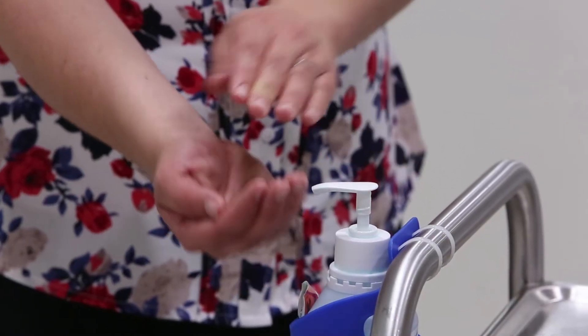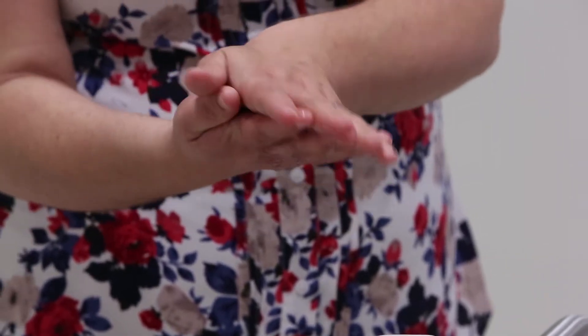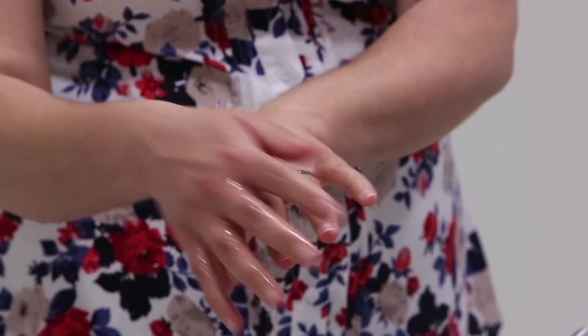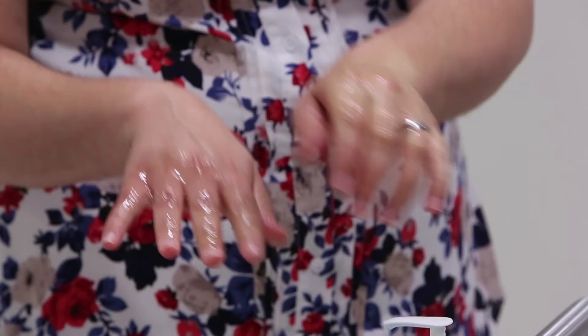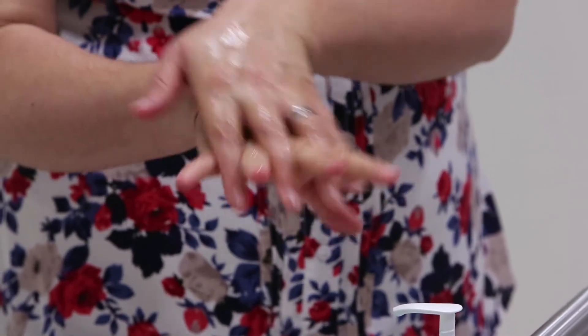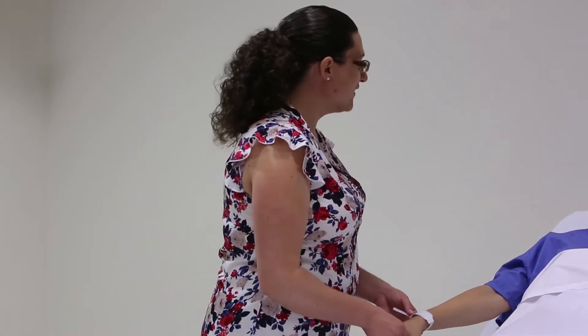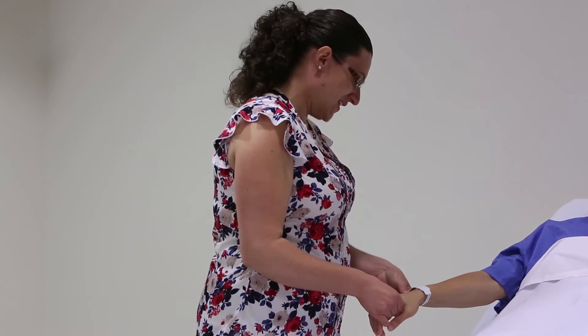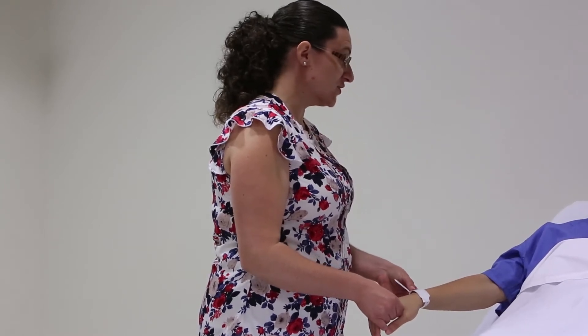Start by cleaning your hands with alcohol hand rub by applying two pumps of alcohol and carefully rubbing your hands until the alcohol has fully evaporated. Introduce yourself to the patient, confirm the patient's identity and explain the procedure.